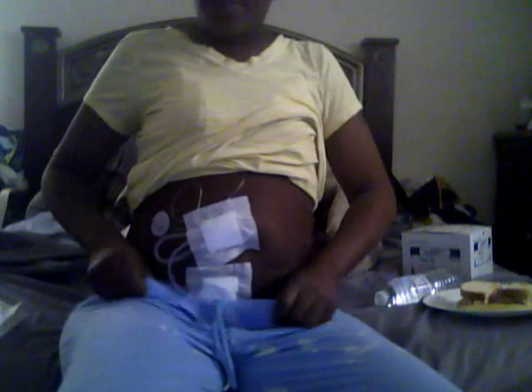But your catheter is secure, it's in place, it's not constricting, the tape is not too sticky, it doesn't hurt. It's the same tape that you use to cover your site, and voila. Pull your pants up, or however you wear your pants, pull your shirt down, and like I said, almost invisible. Voila. And that is how to secure your catheter.